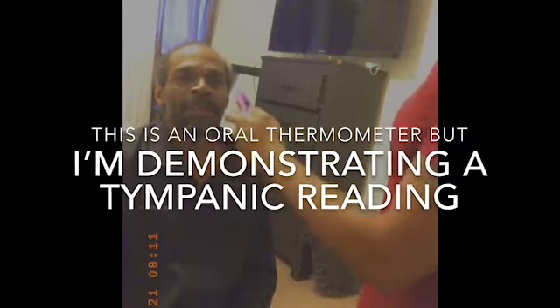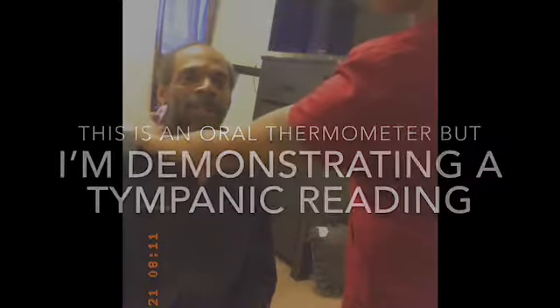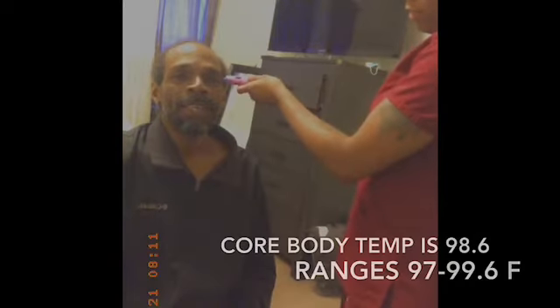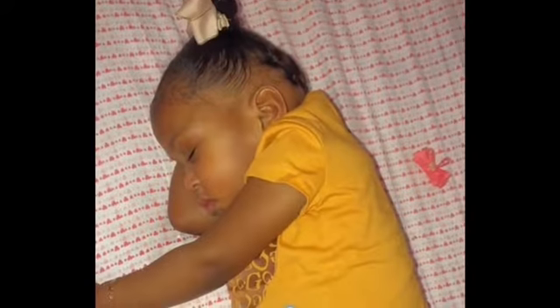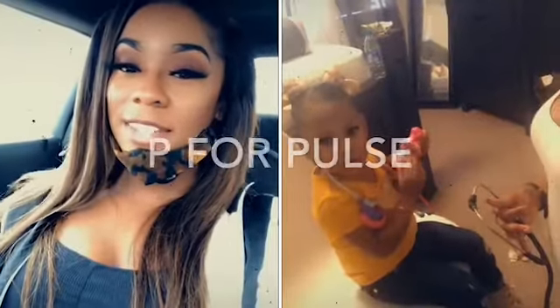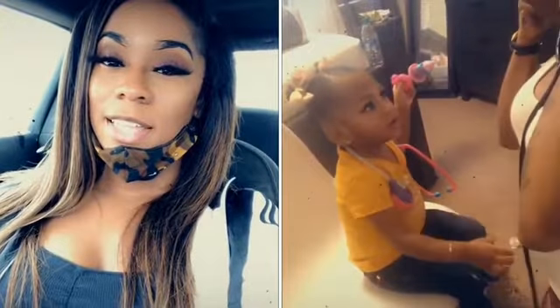I'm going to turn it on. It goes back. You go back behind your ear now. You can take a temporal artery right here until it beeps, and then you look at it. You can do oral, but it's contraindicated in children and people that are unconscious. Axillary, rectal, and yeah.